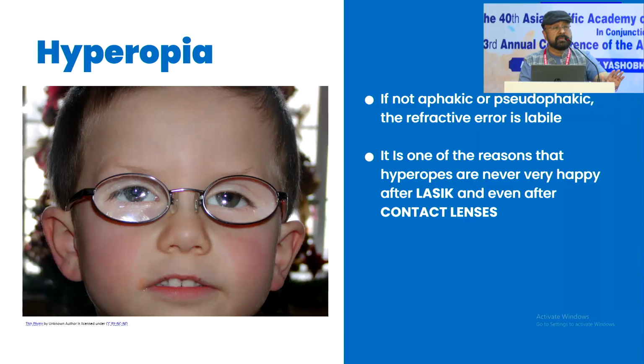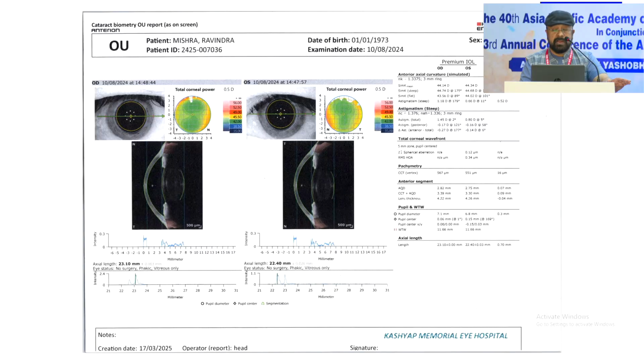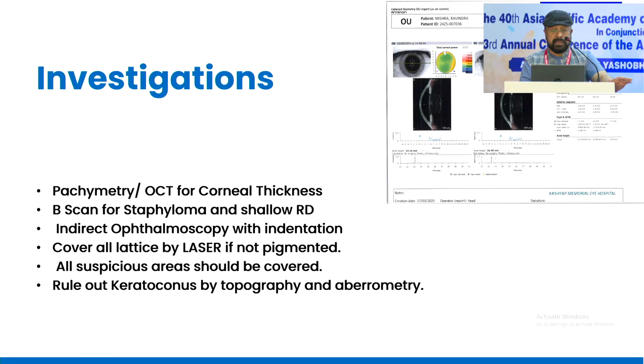Take into consideration all the investigations. The formula for the IOL power calculation is very, very important. And during the operation, you have to be very careful about the procedure.